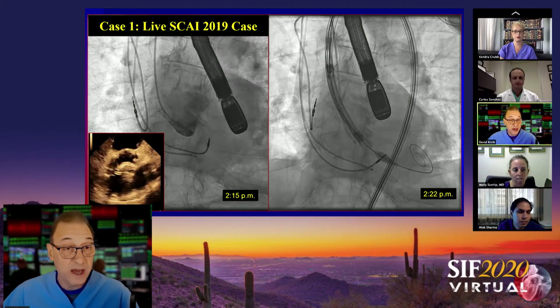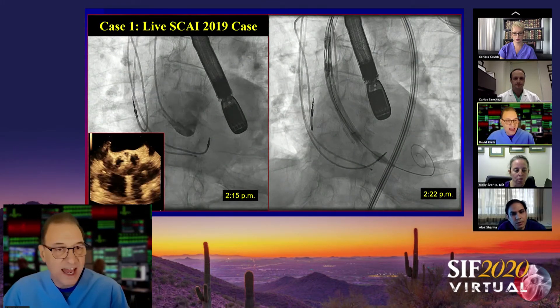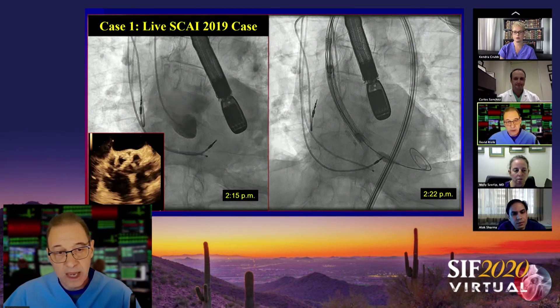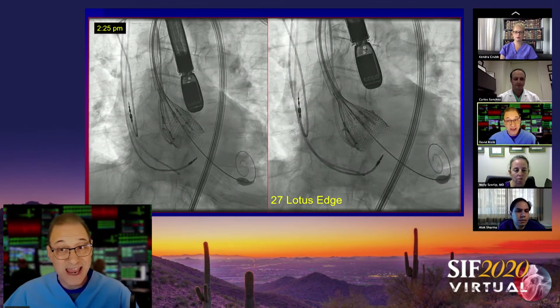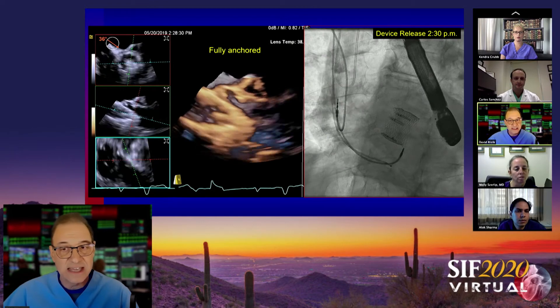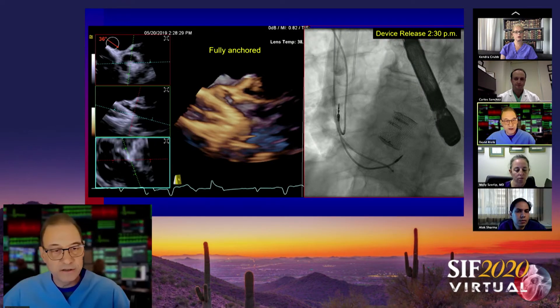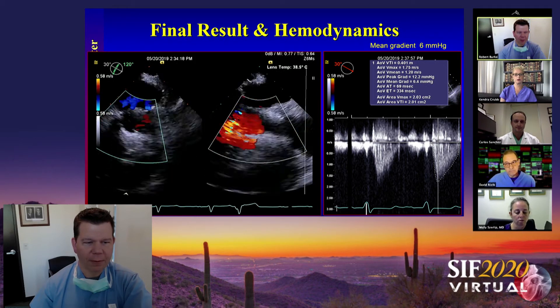Here's a case we did for SCAI 2019 — a live case. I've inset timestamps on the images. We went live at 2:15, and by 2:22 we were across the valve. We started our deployment at 2:25 and had pretty good anchoring of the device. Bob, by 2:25 you can see pretty solid anchoring. On TEE we're not fully deployed yet, but it's anchored nicely in the annulus. You can see on the biplane imaging there's really no paravalvular leak. The image on the left is at the base of the TAVR and there's no evidence of leak there.